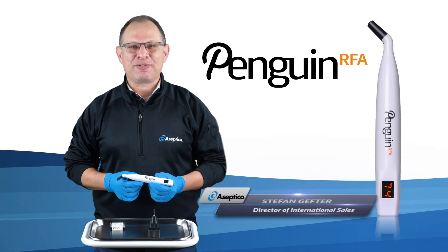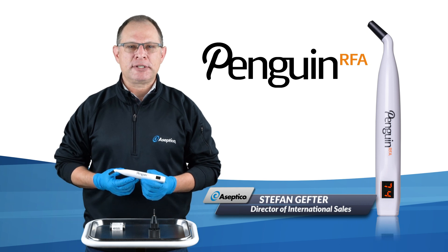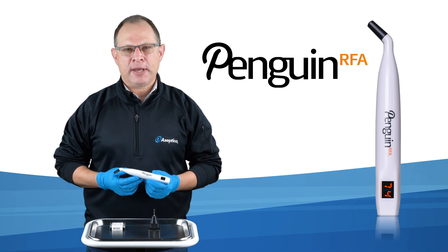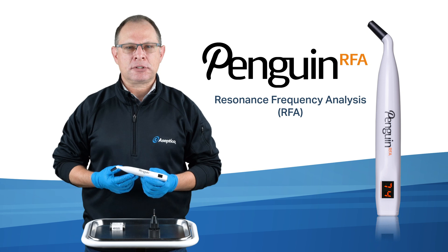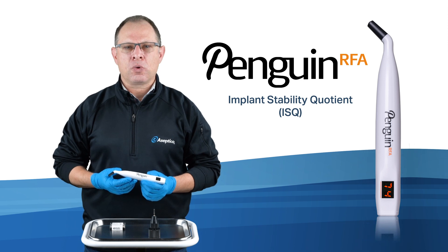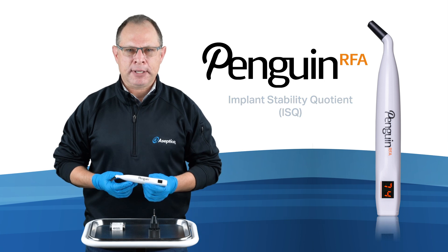Hi everyone, this is Stefan Gefter from Aseptico. I'm here to show you an innovative device that helps dentists reliably and affordably measure and monitor implant stability — the Penguin RFA. The Penguin uses Resonance Frequency Analysis to predictably measure implant stability, providing dentists with an ISQ, or implant stability quotient value, to support their decision of when to restore the implant.